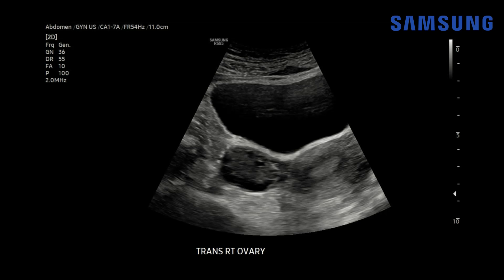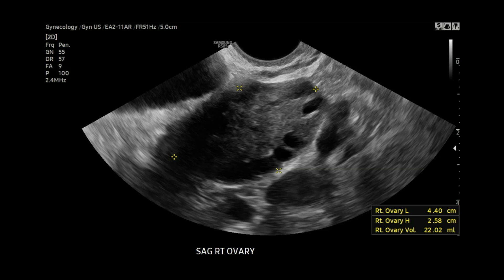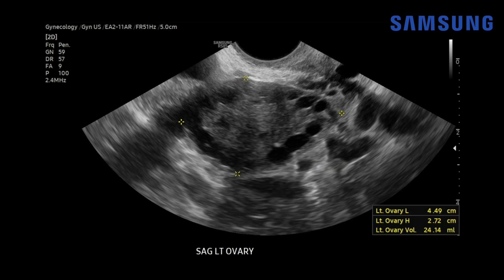Similar findings on the right ovary — peripheral distribution of these small follicles. When we evaluate that transvaginally, you can see the ovary is very large. It measures 22 cc's, much greater than 10 cc's, again with these peripheral follicles. Similar findings on the left — this ovary measures 24 cc's. So this is a typical appearance for PCOS on ultrasound.